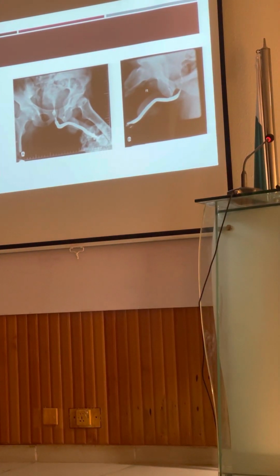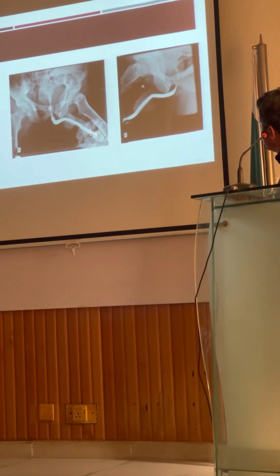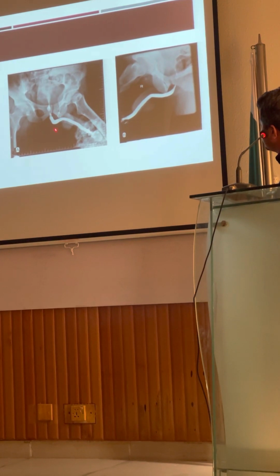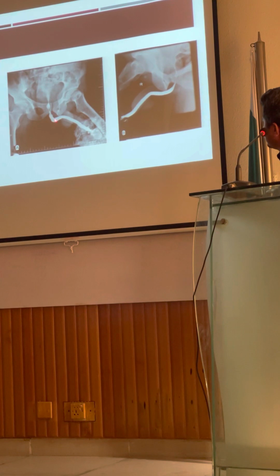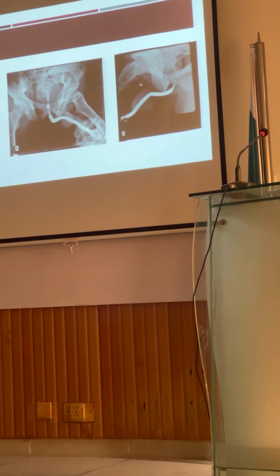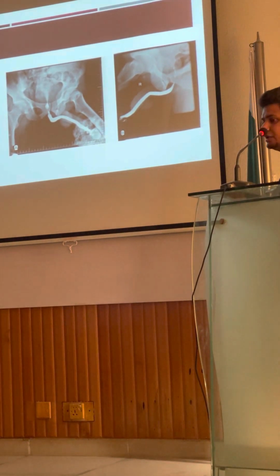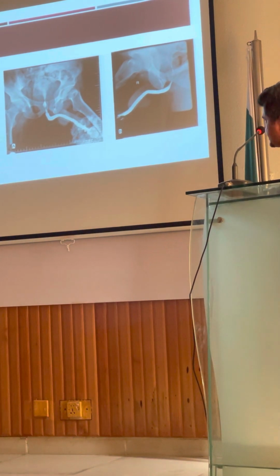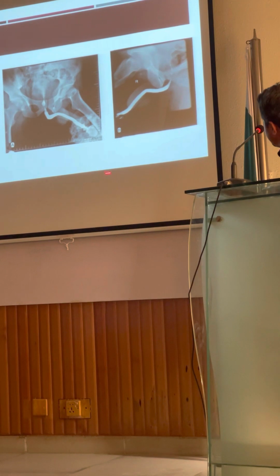Now, this is a typical, normal urethrogram. Here you can see the penile urethra, and this is the bulbar urethra, and then we have this narrow part that you see. This is basically the membranous urethra, and then we have the prostatic urethra. Sometimes, just before the bulbar urethra ends, there is a little bit of dilatation, called the bulb of the urethra, so it should not be confused with a dilatation.